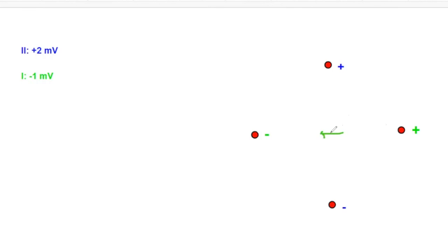It's going up and it has magnitude 2, so we need to make it twice as long. And so then if we add these two vectors together, we should get our total vector, which is going to go kind of 1 in this direction. It's going to go out 1 and then up 2, so it's going to be about like that. That make sense? You'd be able to do that if I give you a signal at this time point. Here's the potential between this lead, and you can make this vector.